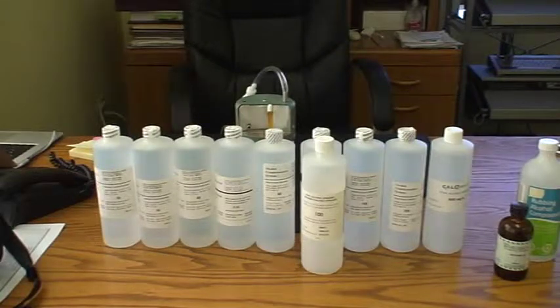When changing the alcohol standard, it's important to think through what type of alcohol standard you're using. For example, displayed in front of you are bottles of alcohol standard that range from 20 milligrams per 100 mils through to 300 milligrams per 100 mils. Or in other words, from 0.02 on up to whatever you would like it to be. The point is that you can buy from a lab alcohol standard of all different concentrations.